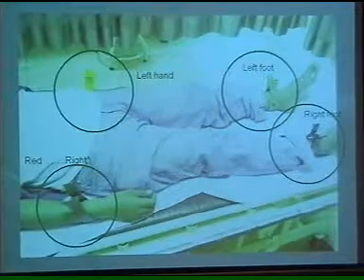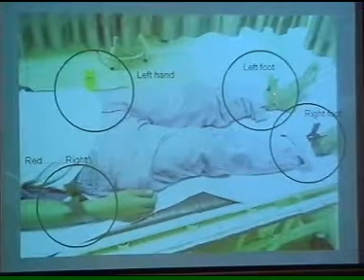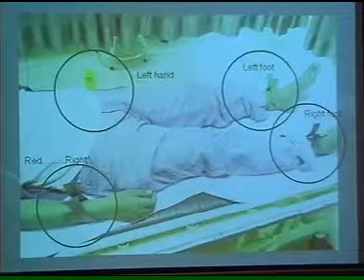The yellow for the left hand. Green, so this is green one, not shown very well in our slides. This is the black one for the right foot.